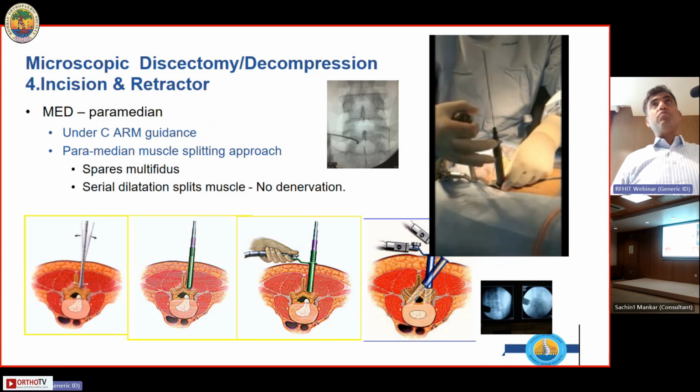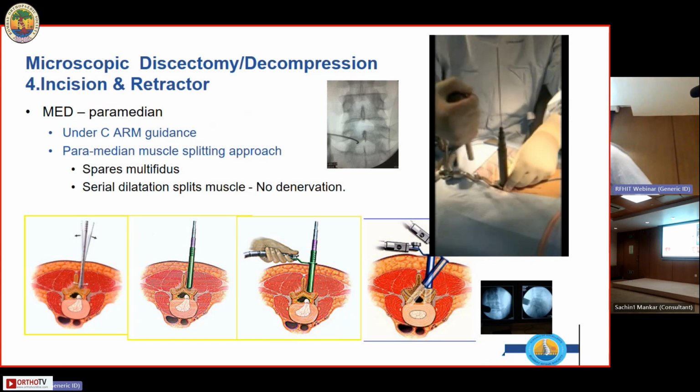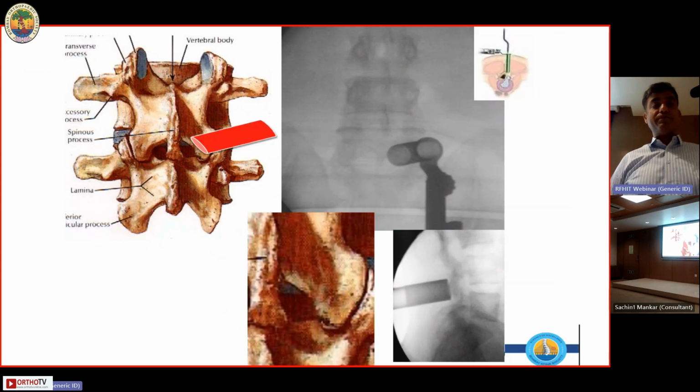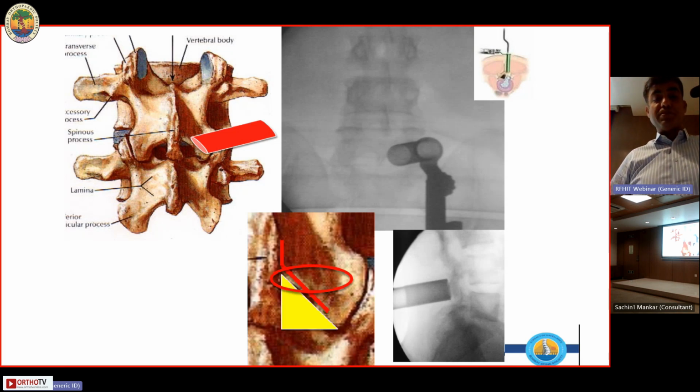And then with the help of these tubular portals and microscopic technique, which helps you to have the vision of the bony area where you have reached down there, you do the same surgery as you do in microdiscectomy. And this is how your tube duct looks like, and the vision, light, illumination and magnification can then be achieved to do the same surgery as we do in microdiscectomy. This is the one bony landmark that really comes crucial, and that's called the spinolaminar line or spinolaminar junction, where all kinds of surgery start, particularly when it is all about microendoscopic tubular decompressions.